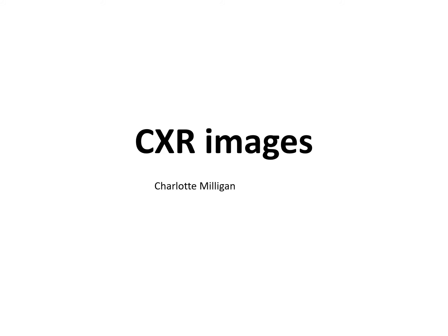Hi, I'm Charlotte. This is going to be a presentation on chest x-rays for students starting with respiratory placement at Leeds Teaching Hospital. It'll be a brief overview, just looking at different sorts of pathologies and chest x-rays that you can come across.